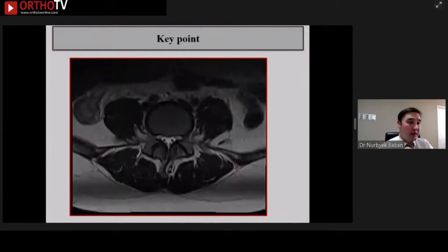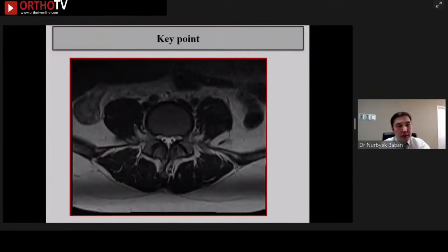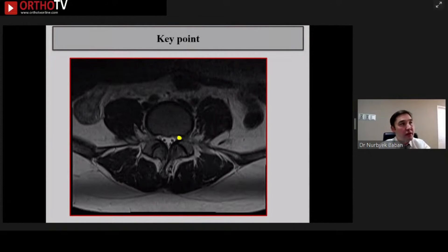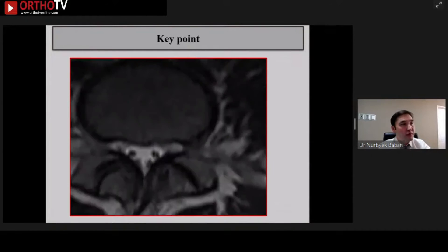Finally, this is my key point. In the axial view, we can see the pedicle. The nerve root is located next to the pedicle. If you magnify this area, you can see the nerve root compressed by the bone.